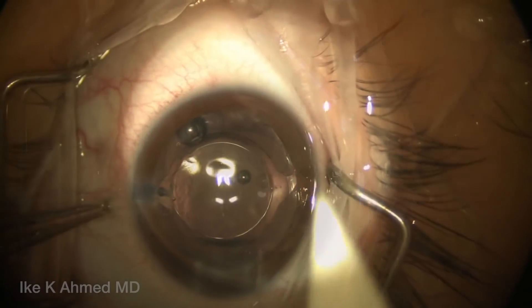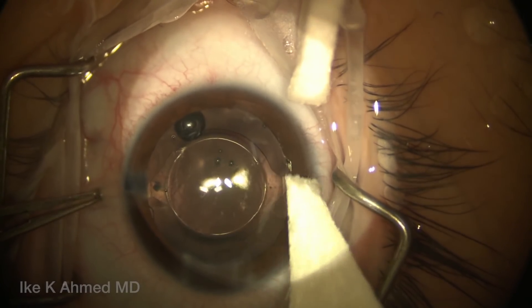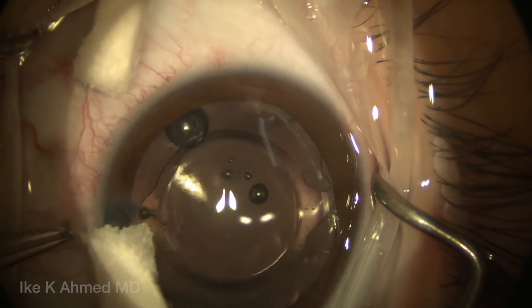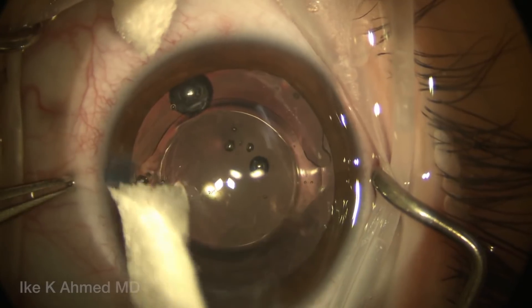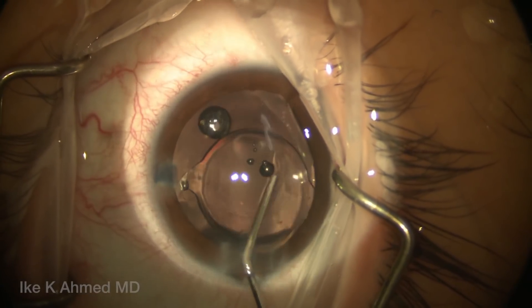Our goal is really to maximize this patient's visual potential as a youngster. We're going to dry the cornea and point out the marks. There's no ink here — we use an inkless system causing just a bit of an epithelial divot. You can see I'm pointing it out right there. Then we will rotate the lens into position using a cannula, with viscoelastic in the capsular bag to facilitate that.